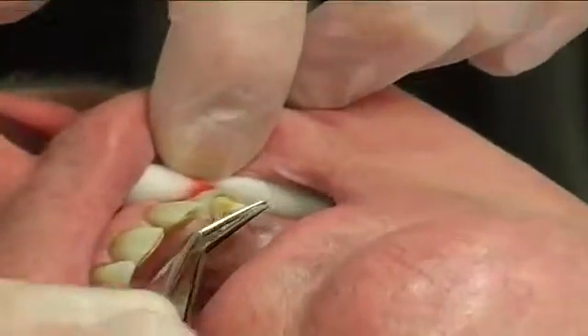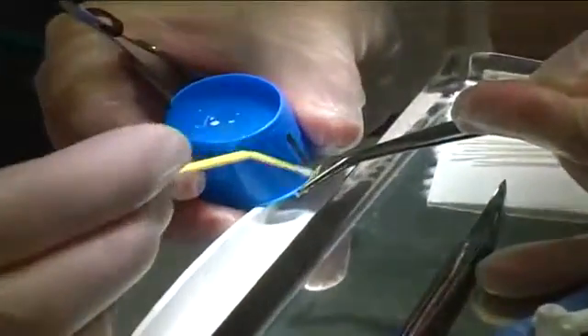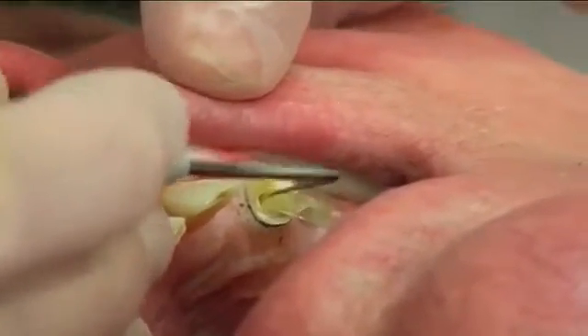The post was fitted inside the root canal. An additional post was shaped and attached to the main post coronally with a thin layer of enamel resin to increase the strength of the coronal part.